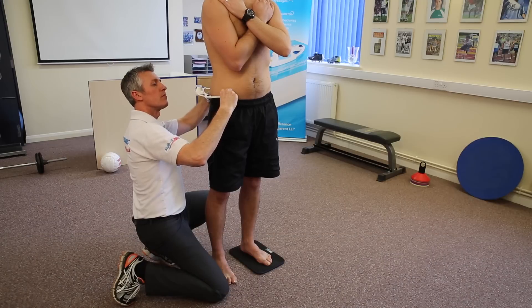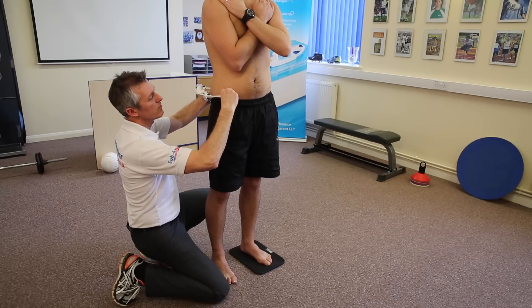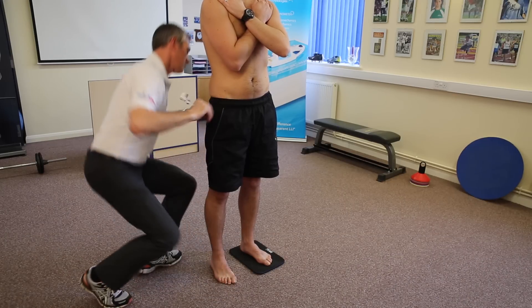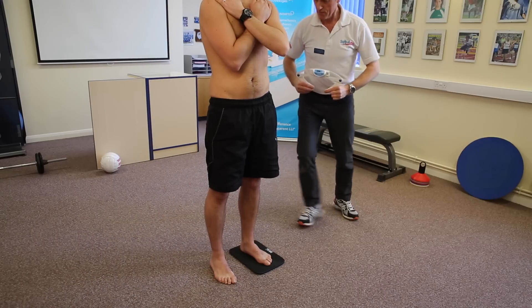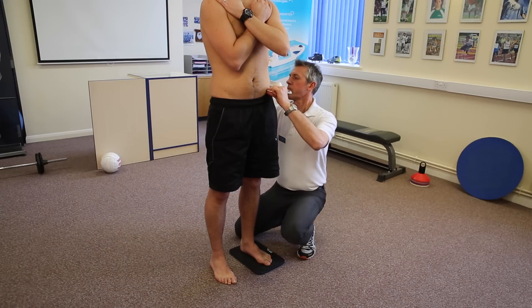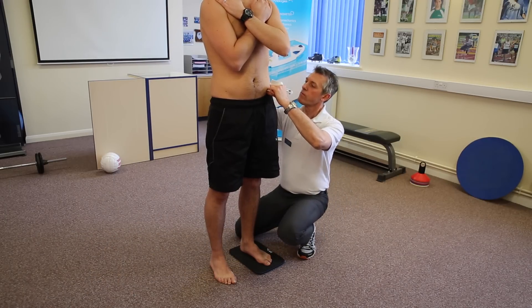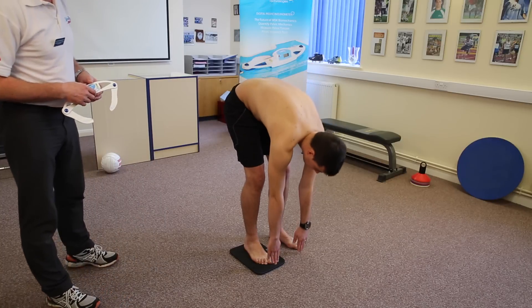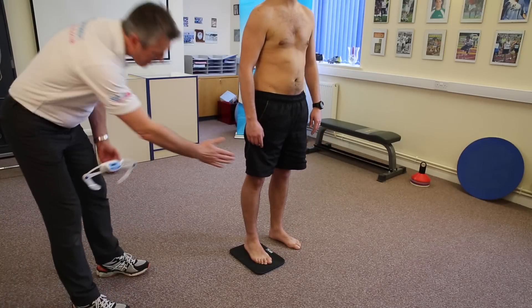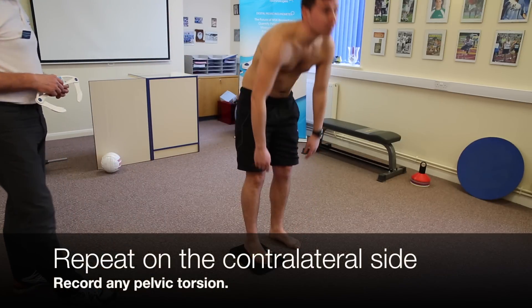We then measure the right side again. We're taking a sagittal plane measurement between the PSIS and the ASIS — measuring the right, then the left. The practitioner is at eye level to the LCD screen so they can see the spirit level as well, making sure that the digital pelvic inclinometer is level in at least two planes.